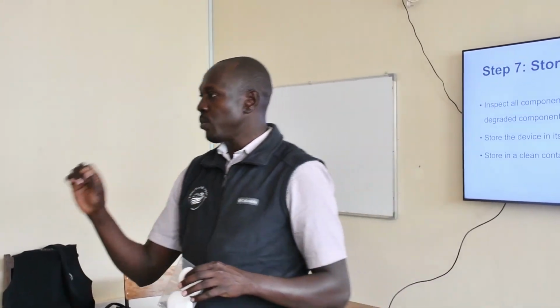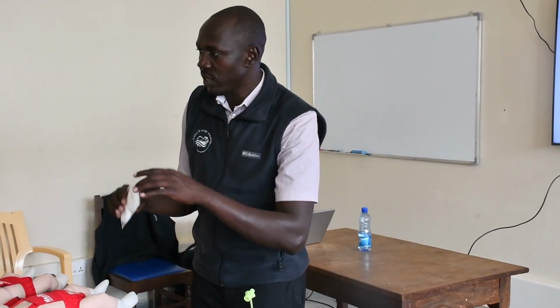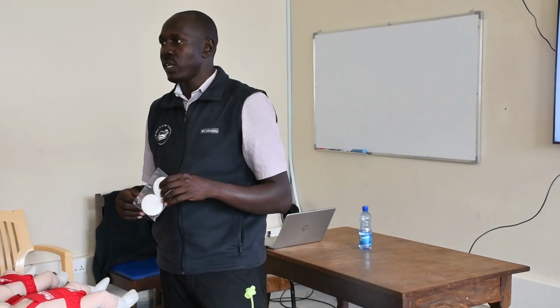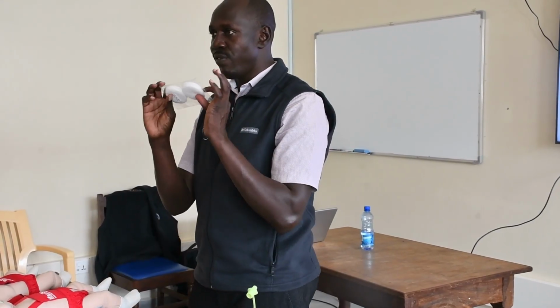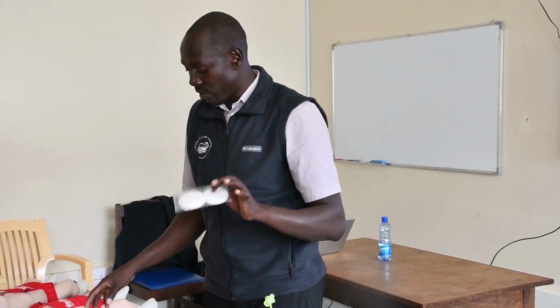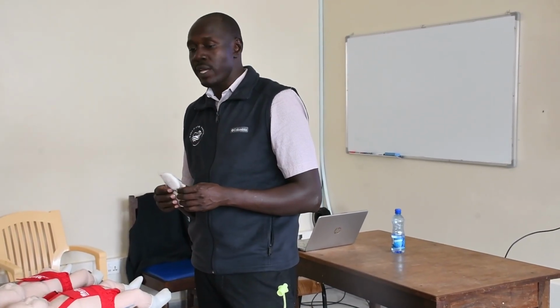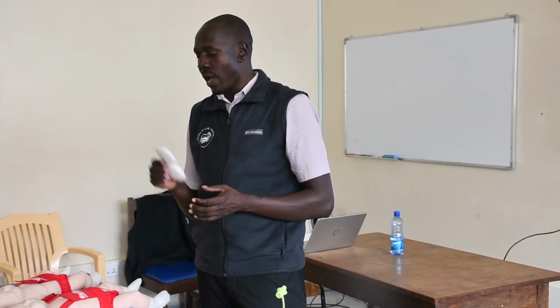the hospital procurement or the hospital supply should be in touch with the distributor. So if these things are finishing, call the distributor. We need filters, they are finishing. We need anything else that you need from the distributor, they will be able to supply. So that's where you can get the filters. Yes, of course they can finish, because if they're a high volume unit, filters can finish.